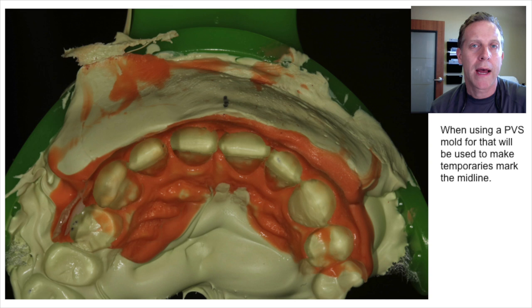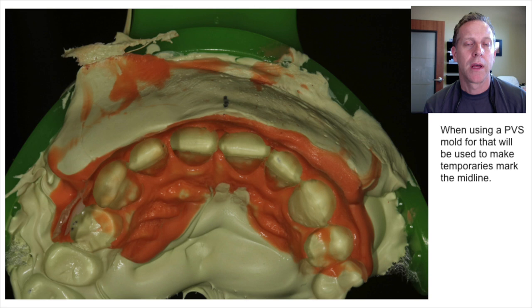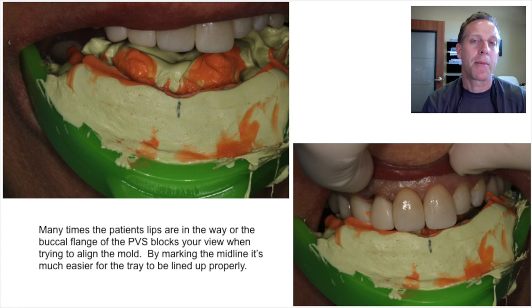We put posterior triple trays in all the time, or even a saddle tray, to line up and get our temporaries made. When it comes to the anterior, it can be a little trickier — especially if the patient's lip is in the way when you're trying to insert this tray, or if the buccal flange in your preoperative model went up too high. Your visualization may be compromised and you may not be able to get it in quite right.